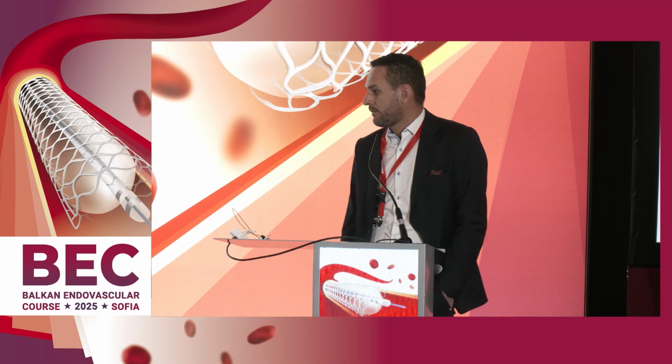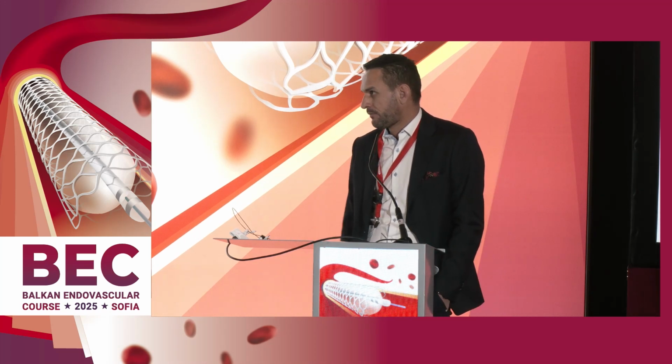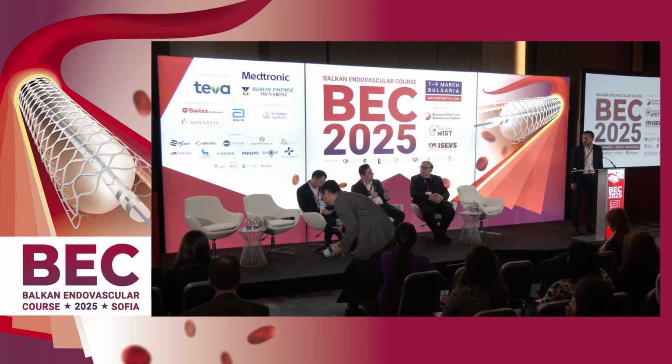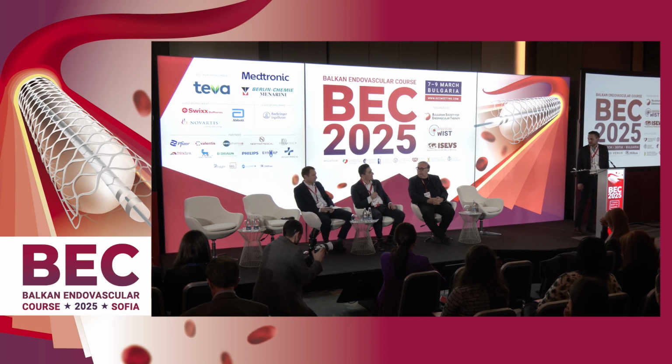We use it now, and for iliac intervention with tibial approach, in 5 patients this year. Thank you. Congrats for this. And my question is, only angiographic targeting of the vessel, or do you use ultrasound? Only angio for the puncture.